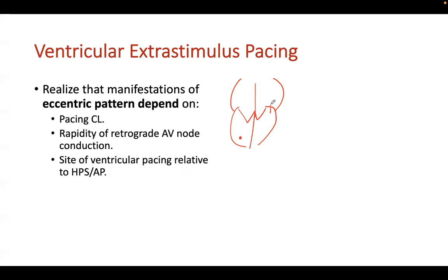And imagine your accessory pathway is very left lateral, and it's in a healthy young individual. Your AV node usually conducts rapidly upwards in most young healthy individuals, such that the atria is activated rapidly across the AV node, and by the time the left lateral pathway is conducting, your atria is mostly depolarized anyway, so you will not see evidence of that eccentric activation. So sometimes you have to pace fast so that you slow the AV node so that this pathway manifests. In pediatrics, this might be tricky because your AV node is very healthy. In adults, less tricky, okay?